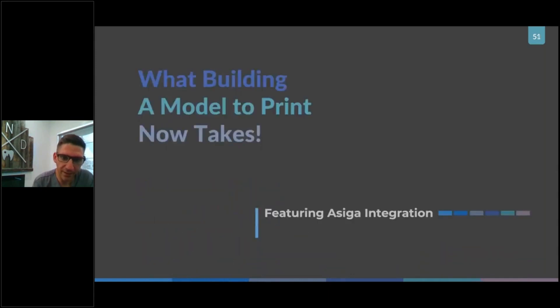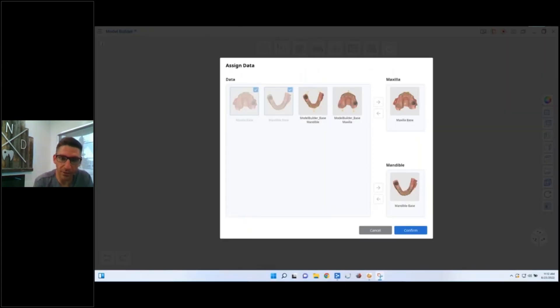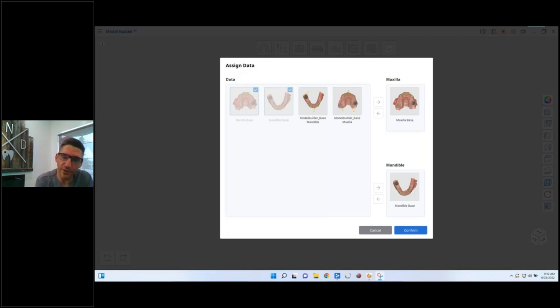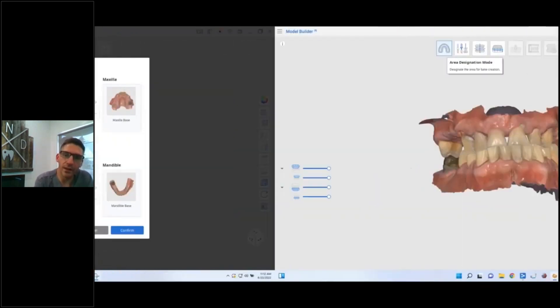So now when we're looking at doing this, it's shocking how fast it is. Click the Model Builder icon. This is Model Builder, this is how easy it is. If you've done your scans in Medit Link, it's automatically going to import them in the maxilla and mandible, it knows. Otherwise you can select it.